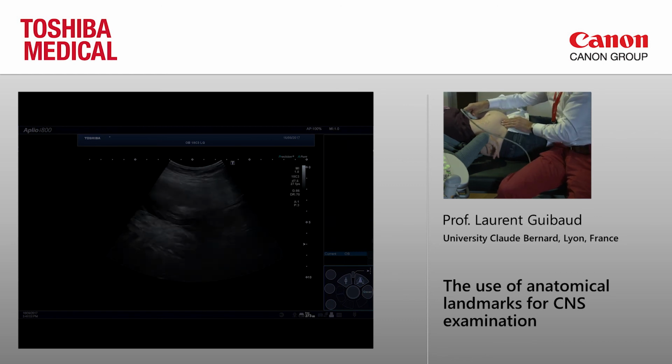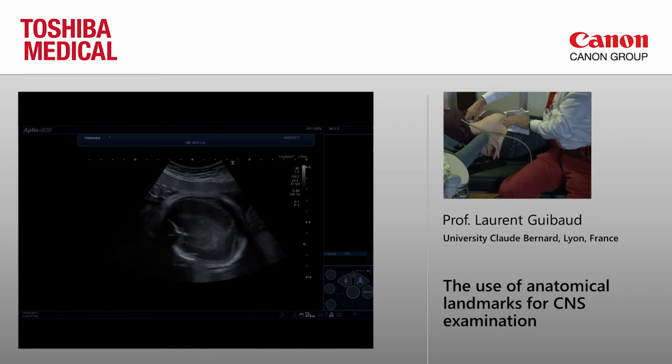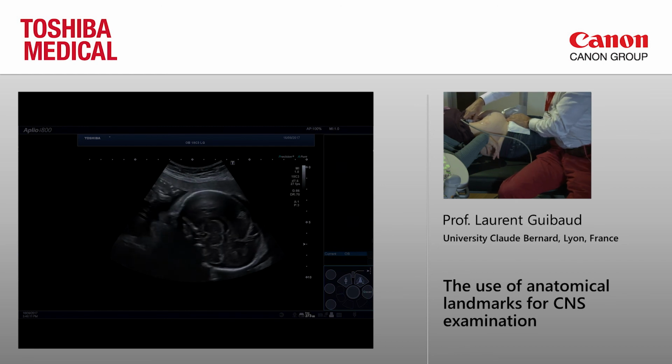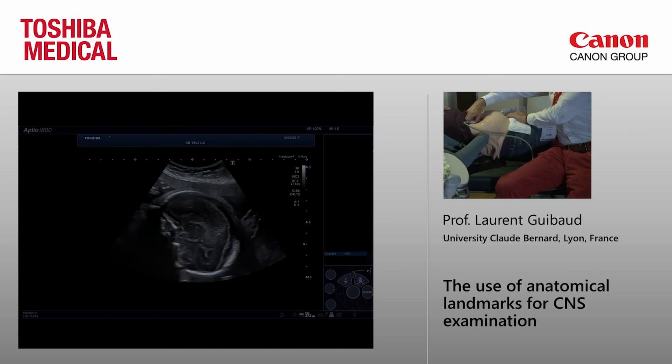Sometimes it's real life, so. You see how far I am with my probe in the belly of the patient.